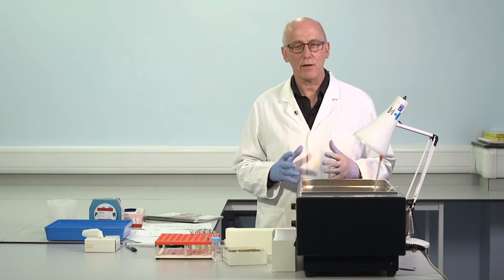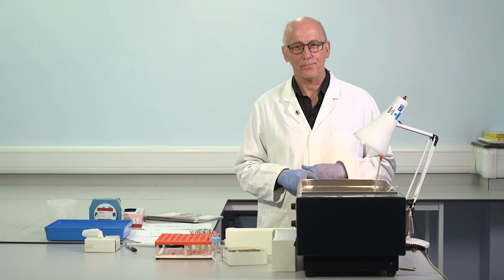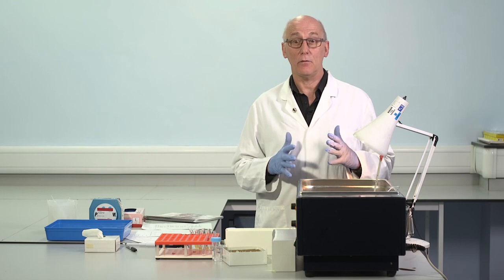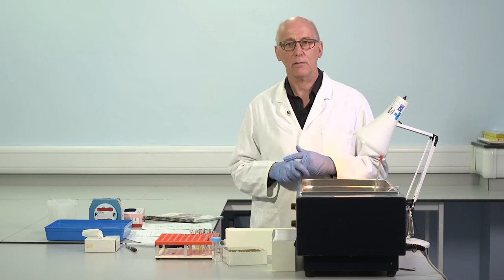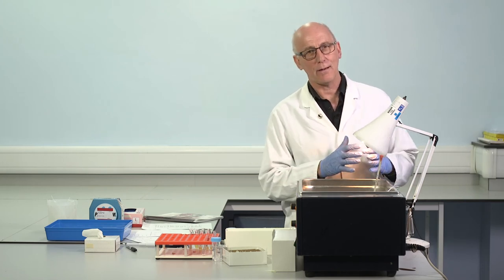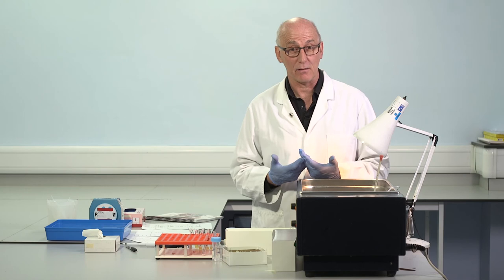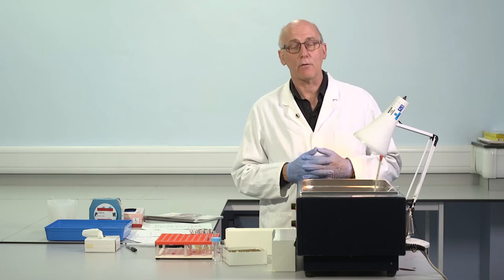many centres around the world, many countries, it's very common practice to perform APTT as a screen prior to surgery, if it's major surgery. Actually, the published evidence and the guidelines available to us recommend against indiscriminate use of APTT, and recommend a targeted approach based on bleeding history. If the patient has a positive history, absolutely make the tests. But in the absence of a positive history, the evidence suggests a pre-op abnormality in APTT is not a good predictor of post-op bleeding or presence of a bleeding disorder. So the recommendations are not to perform APTTs in mass pre-op screening. Nevertheless, it's very common practice in many centres, sometimes for historical reasons.